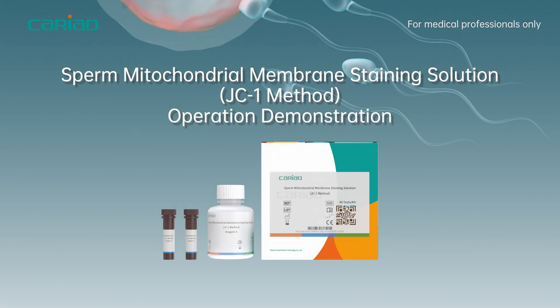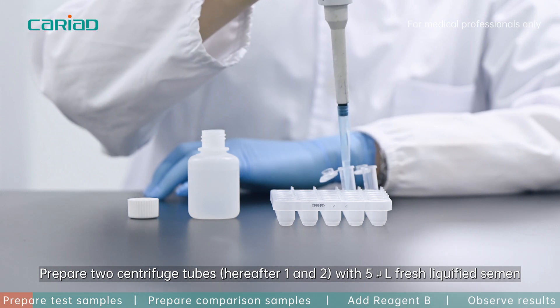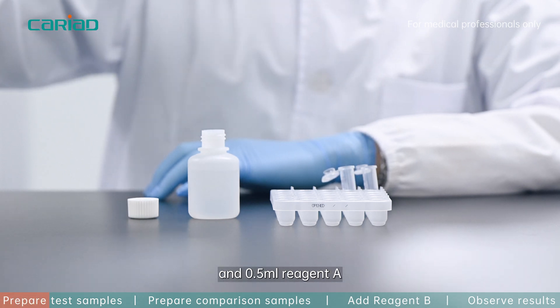Sperm mitochondrial membrane staining solution JC-1 method operation demonstration. Prepare two centrifuge tubes with 5 microliter fresh liquefied semen and 0.5 milliliter reagent A.